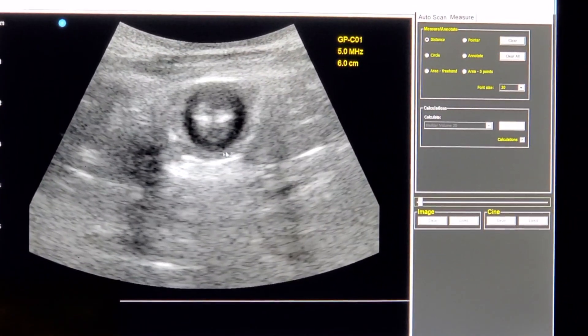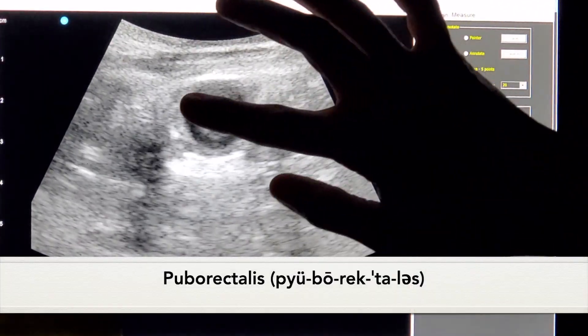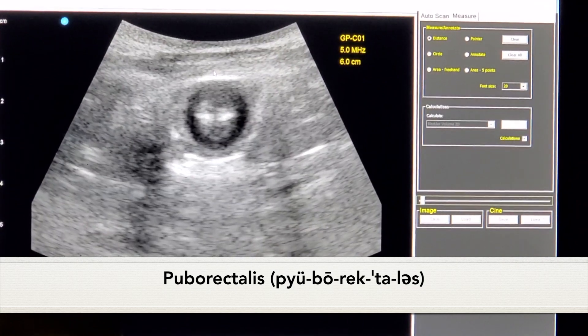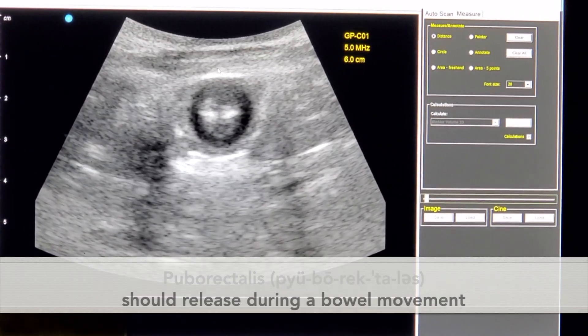What you see here is the muscles around the pelvic muscles, around the anus. You can even see the puborectalis — this dark shadow here — and that's the muscle very commonly known because of the Squatty Potty that also helps us stay continent, but we want it released during a bowel movement.